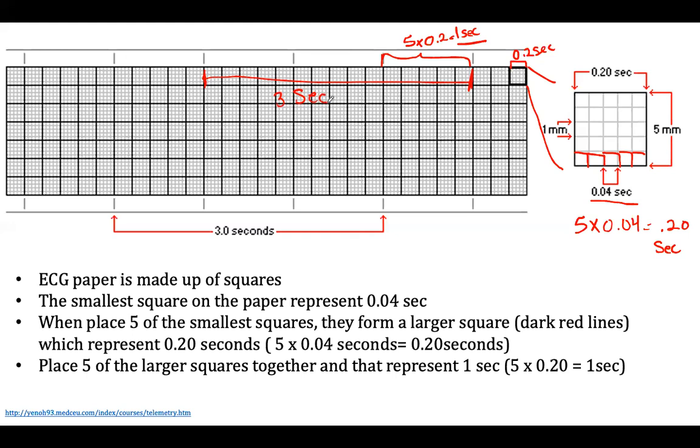What if I want to do 6 seconds instead? So all I need to do is count 15 more boxes, which I don't have on this side, but count 15 more boxes, and that adds up to 6 seconds.